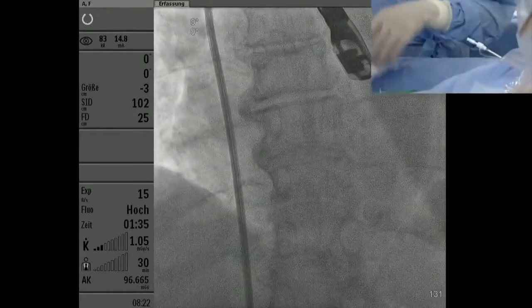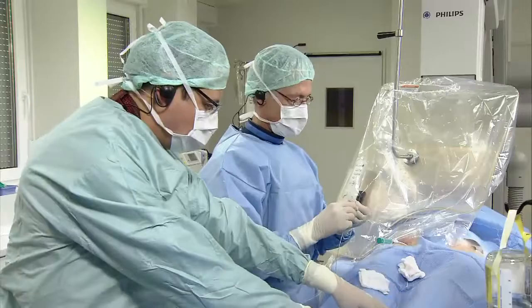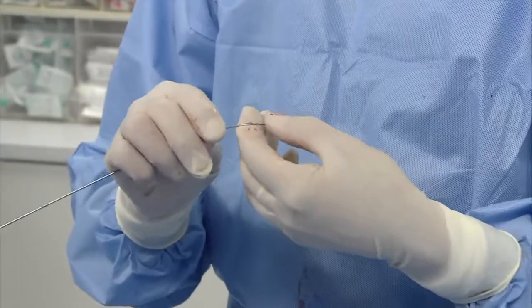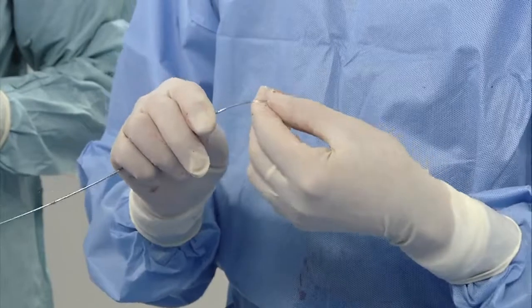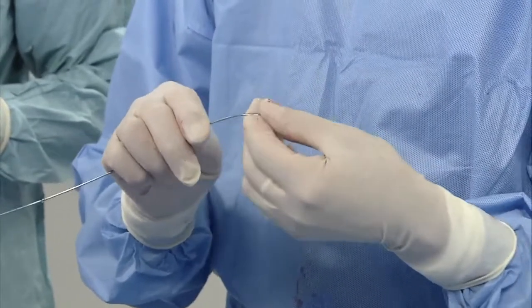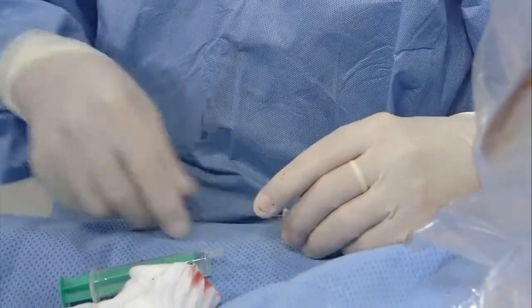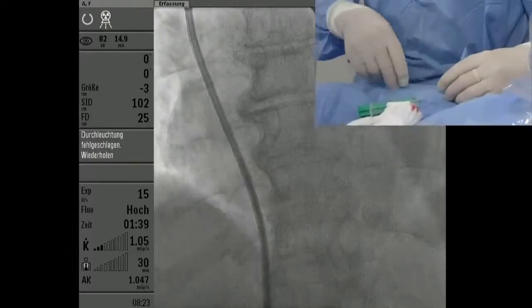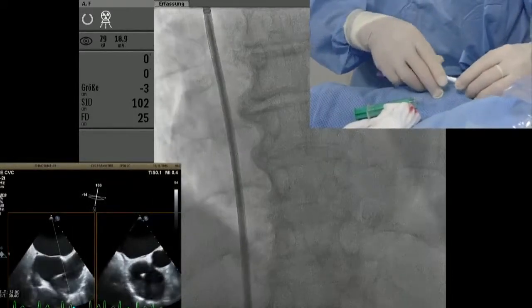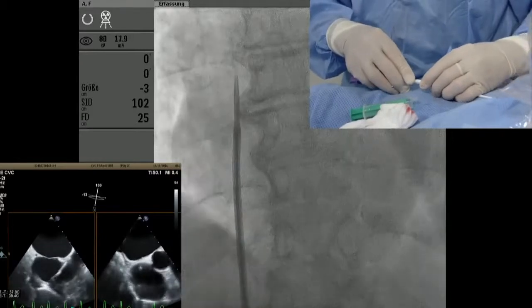So we discuss it, do you have any other technology available? We have the Baylis stand here with its NRG needle and, of course, the radio frequency wire. Do you have that available or not? No, we don't have that. We have used it in the past, but just for live cases, we don't use it. The problem is rarely that we cannot get through the septum. In this case, I need to have the contact because I want to see where I puncture. So I make more bending here. If you have the situation that we cannot cross, which happens in 1 out of 1,000 or so, then you can use, for example, laser. We have the laser in our lab. I remember a case of a paravalvular leak where we had to use that long time ago.